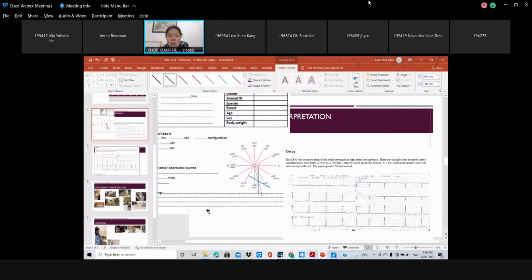Then you go back to your lecture notes. It's still normal, because the heart is positioned slightly to one side like that. I will show you in the radiograph what that means, where the bulk of the muscles are. So the mean electrical axis for this dog is roughly about 75. Okay?